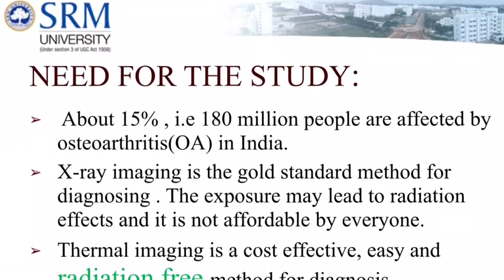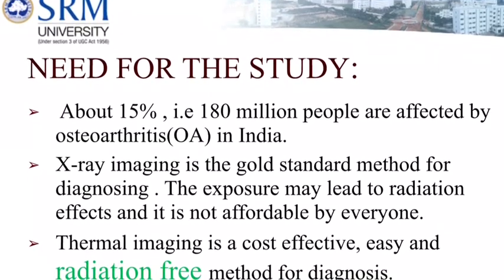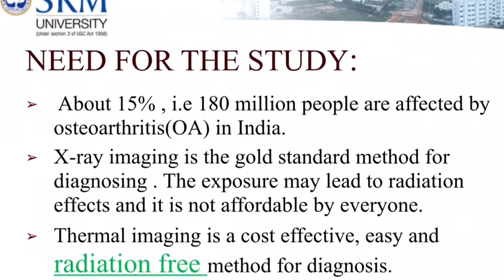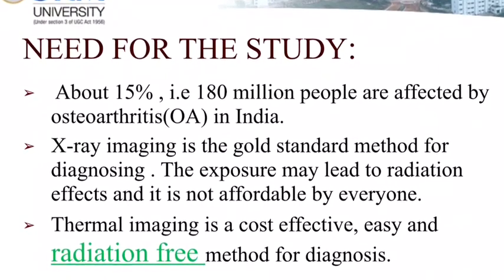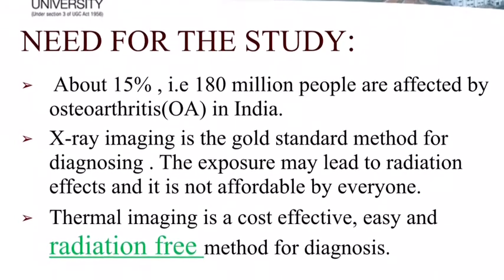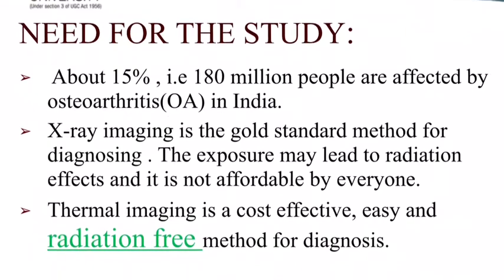It has been estimated that about 15% of the population in India is affected with osteoarthritis, and X-ray is being used as a standard technique for diagnosing osteoarthritis. Since X-ray is a radiographic technique which may lead to harmful effects in future and is not affordable by everyone, this imposes a need for an alternative diagnostic technique, which is thermal imaging. Thermal imaging is a cost-effective, easy and radiation-free method for diagnosing osteoarthritis.